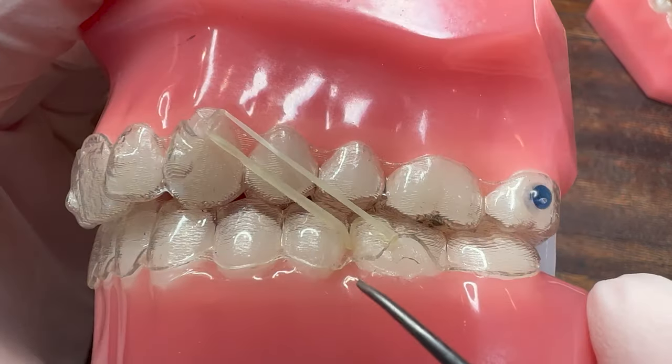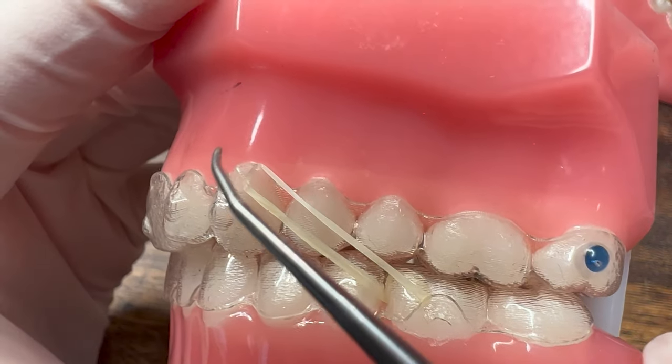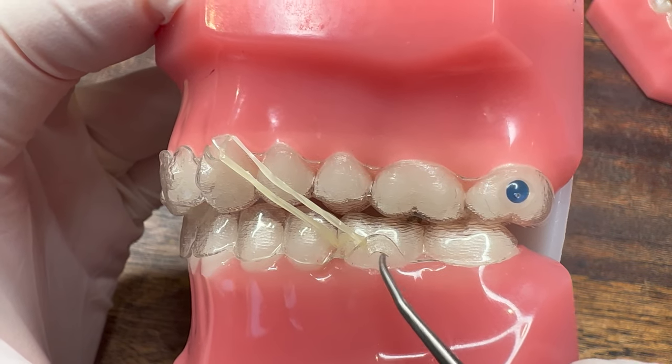Again, sometimes you might have to cut this corner a tiny bit to get a little notch for it to stay on. This way you can still wear your rubber bands even though you've broken a hook off the lower tooth.